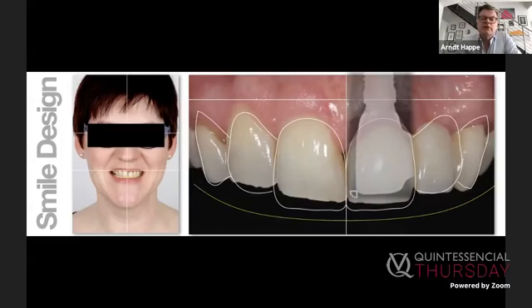So this is the new implant position. We cannot really focus on local landmarks. We have to go through all this analysis and do a planning and then accomplish this new implant position. Because if we just use local landmarks, we will end up completely without any restorative planning. So the restorative planning has to go first, and then we will find this implant position, which is in this case 3 to 4 millimeters apically of the future soft tissue margin. So it has nothing to do with the tissue you find there, more or less. You want to define where you want to have your tissue in the future.